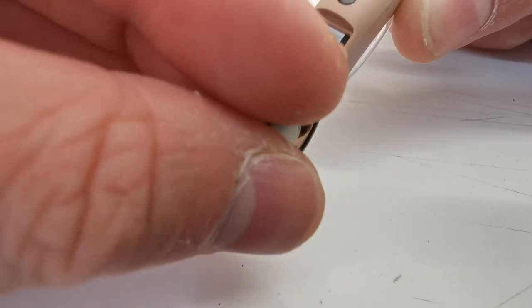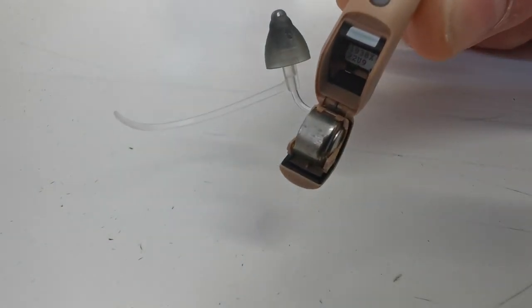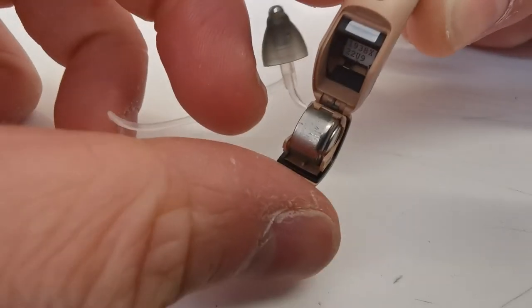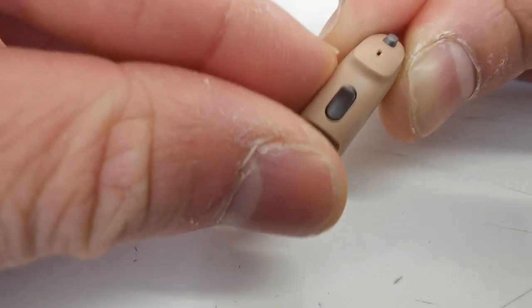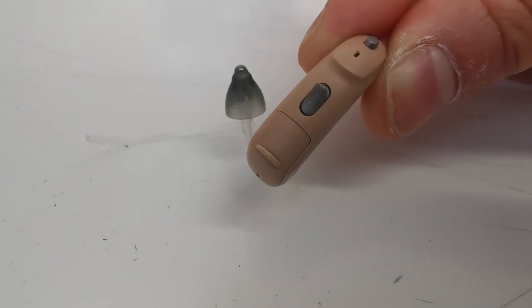The correct orientation is with the flat side towards the left. Close the door to activate the hearing aid. This is how you change a battery.